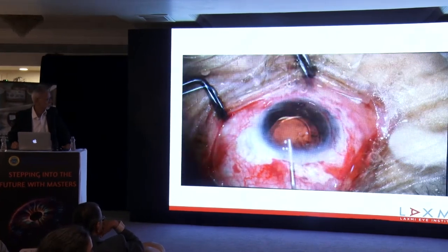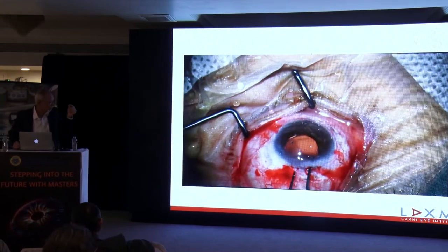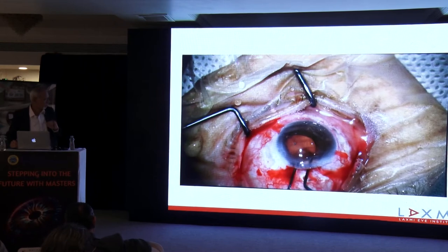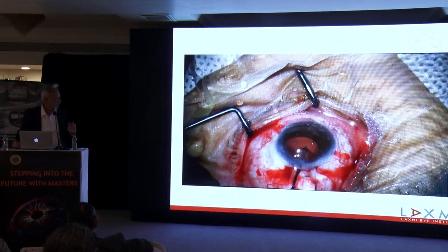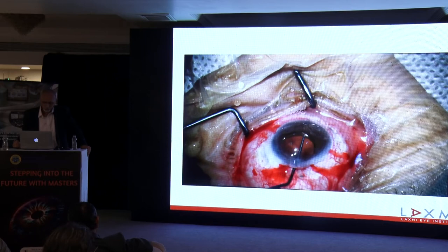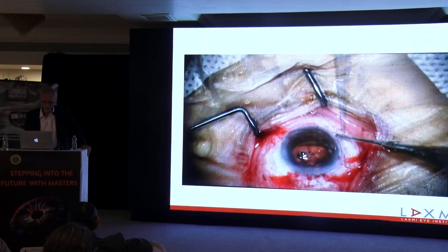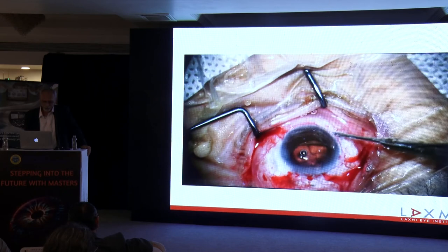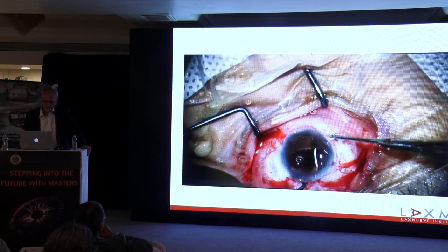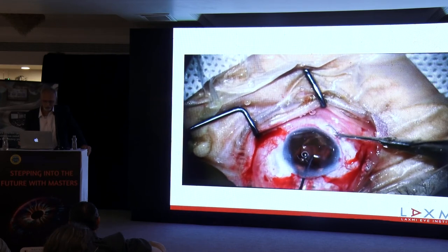You can see that. First and foremost, one thing I could have done was to just pull that haptic and cut it, but I was afraid that if I cut it and the lens falls in, it will become a little difficult to get it out. First I had to stabilize this, but at the same time make sure that the haptic that is exposed doesn't go in. And I had decided to cut it as much as I can, because even that small portion that had remained open for a long time should not go in. And once I had enough of it outside, I cut it.